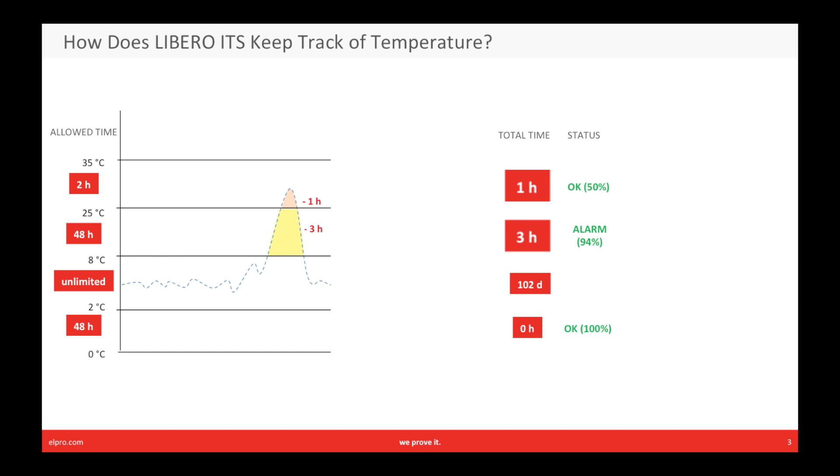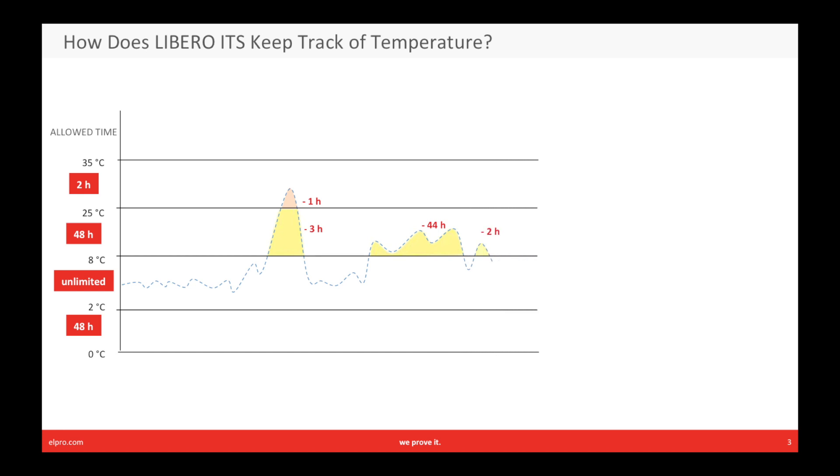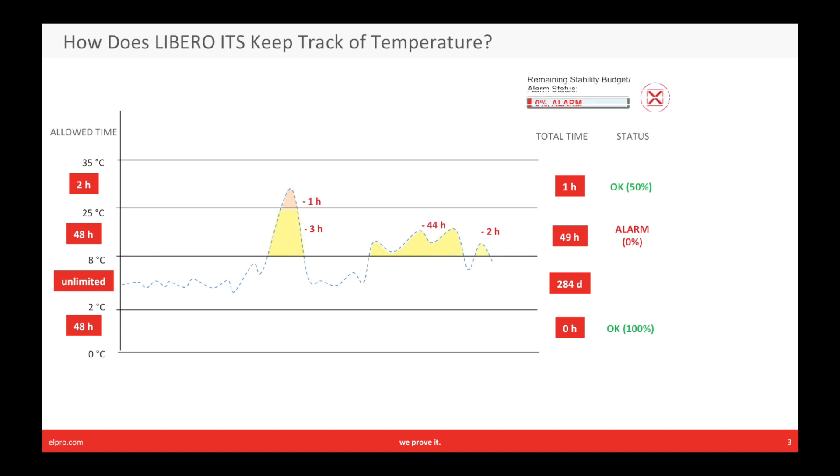The overall status shows the worst case scenario: 50%. Now our journey continues, with a second temperature deviation of 44 hours and a third with two hours. The total accumulated time is now 49 hours in the zone between eight and 25 degrees. Comparing with the allowed time, the stability budget has been used up. Therefore, the overall status is shown as 0% and in alarm. The LED on the device also now shows red.